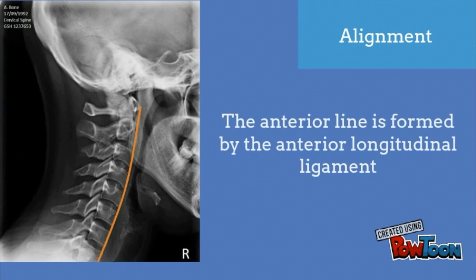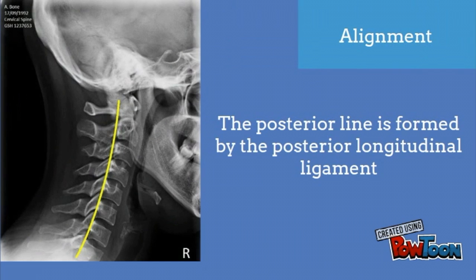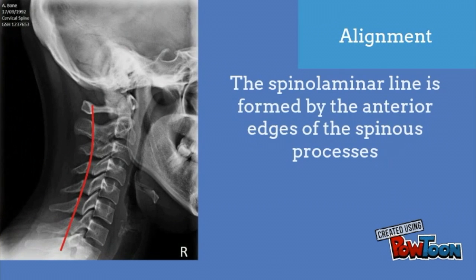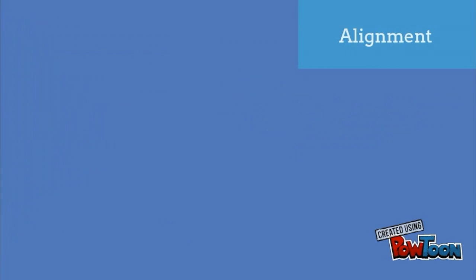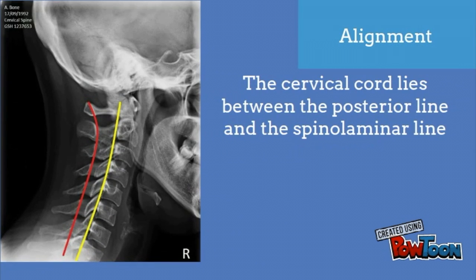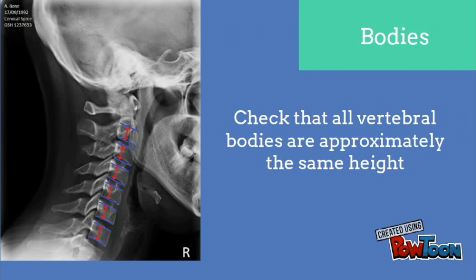Alignment: the anterior line is formed by the anterior longitudinal ligament — draw this by joining the anterior portion of the vertebral bodies, and this should form a smooth continuous curve anteriorly. The posterior line is formed by the posterior longitudinal ligament, drawn joining the posterior borders of each vertebral body. The spinal laminar line is formed by the anterior edges of the spinous processes and is particularly important for subluxation of the vertebra. The cervical cord lies between the posterior line and the spinal laminar line. Check that all vertebral bodies are approximately the same height, as shortening of a body may indicate a compression fracture.